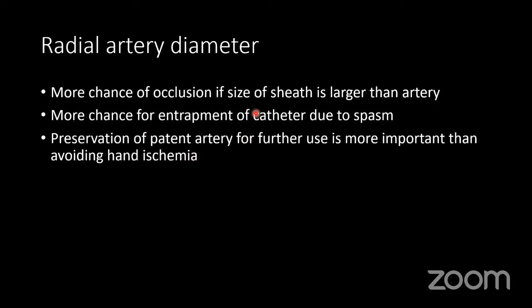And about radial artery diameter, if the radial artery is small, there is more chance for occlusion, and more chance for entrapment of the catheter due to spasm.